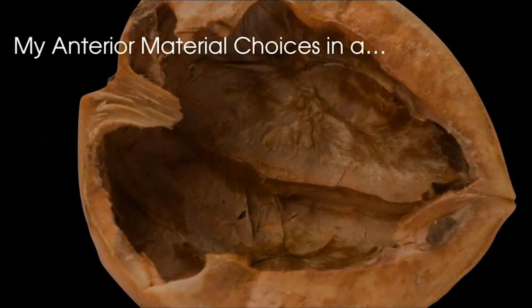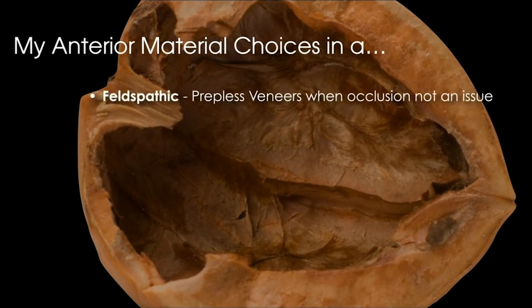So my material choices for anterior teeth, in a nutshell: I like feldspathic porcelain for prepless veneers, and when occlusion is not an issue. You can't build them too high, and they're a pretty material, very glassy. I think it's the prettiest of the porcelains out there. They're very lifelike. They're as much like real tooth structure as I've seen on excellently made feldspathic veneers.